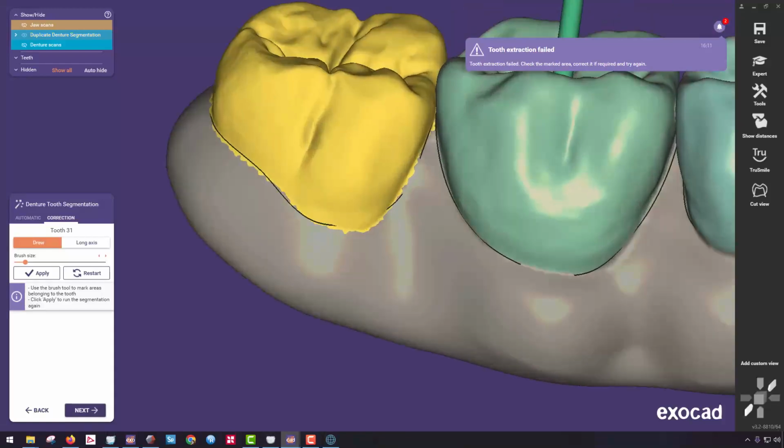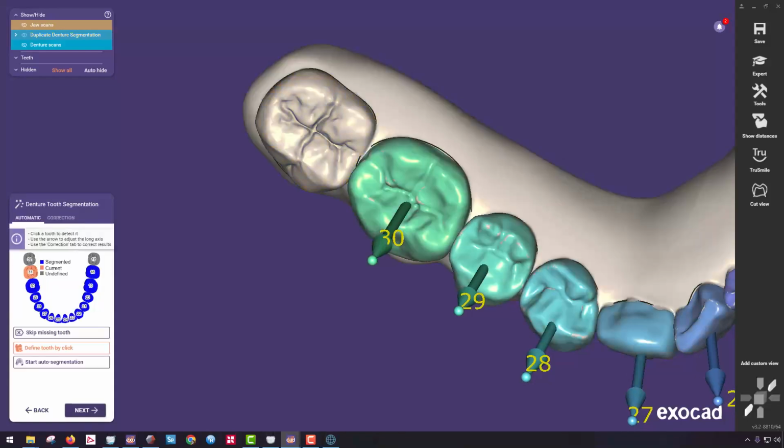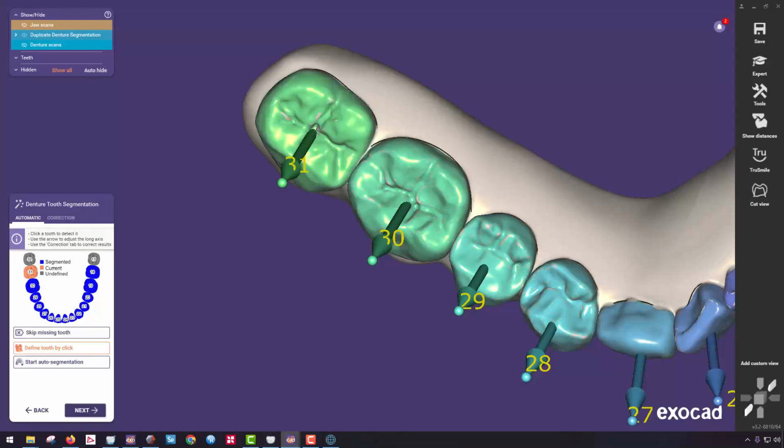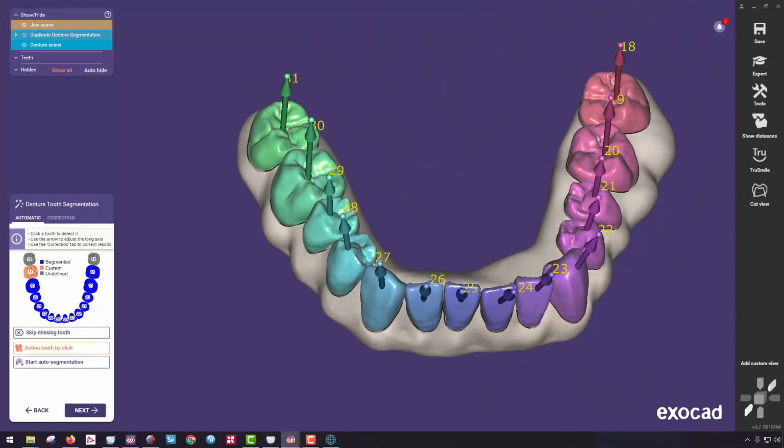Everything here works. Oh, let me just go ahead and clear my long axis. And let me go ahead and do this one. Try that with a slightly different orientation. And then that found it. Great. So you sometimes toggle back and forth and it will nail it.